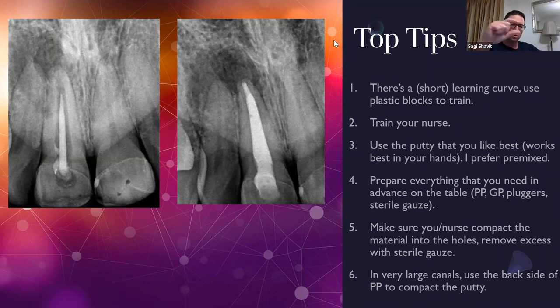All I do when I use the capsules is extrude a bit on my pellet former, compact, extrude a bit, compact, extrude a bit, compact, and put it back on, so it's kind of non-clinical and doesn't go in the patient's mouth. And then I wipe them with whatever cleaning disinfectant wipes, clean them, dry them well, and then put them back in the bag. Yeah, perfect.